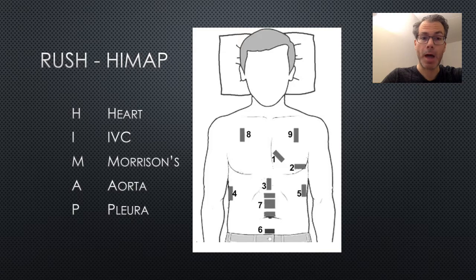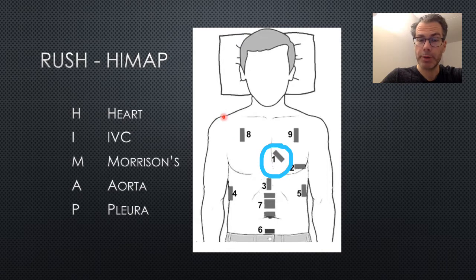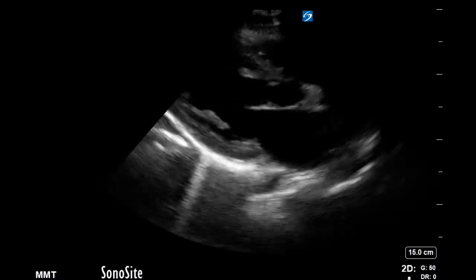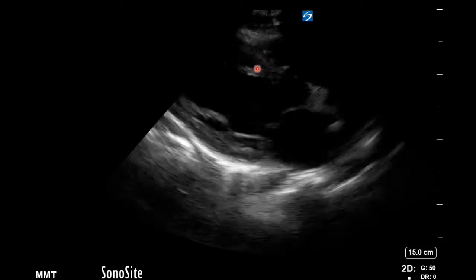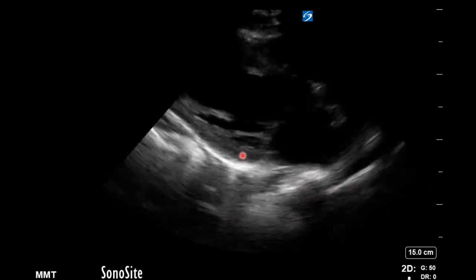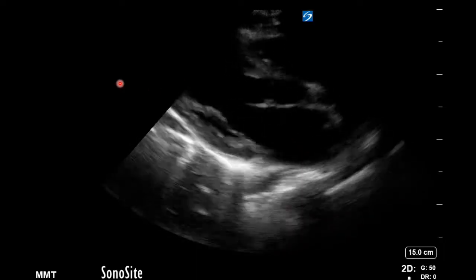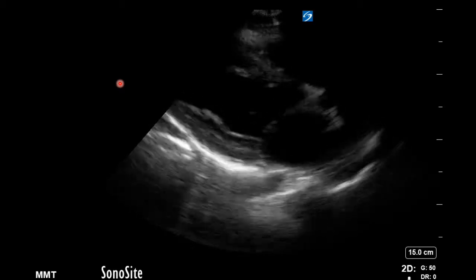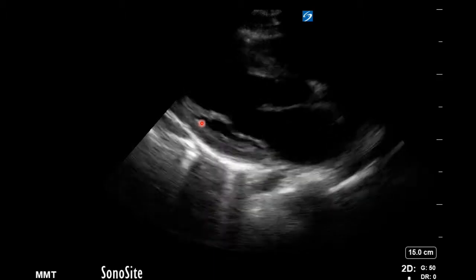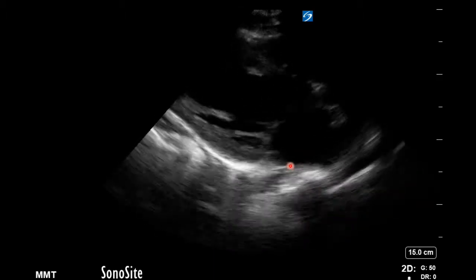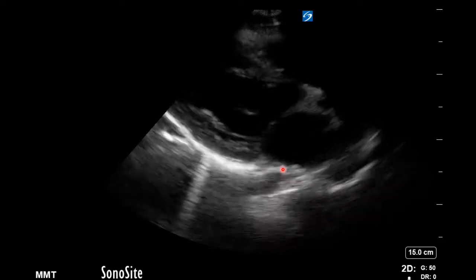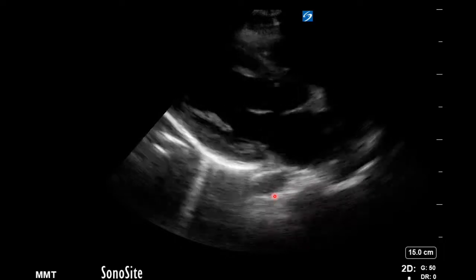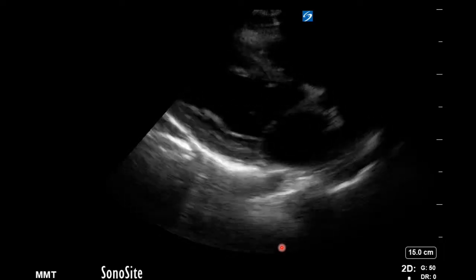First we looked at this young man's heart using the parasternal long axis view. The probe marker is to the patient's right shoulder and the ultrasound beam goes through the long axis of the heart. We have a bit of right ventricle at the top, left ventricle, left atrium, and mitral valve. We look for tamponade, RV strain, and LV function. Pericardial fluid tends to accumulate behind the heart between the myocardium and the pericardium, pointing in front of the descending aorta — as opposed to pleural fluid, which goes behind the descending aorta. There was no pericardial fluid, so no tamponade. The RV didn't appear dilated, though we'd need to check on other views.